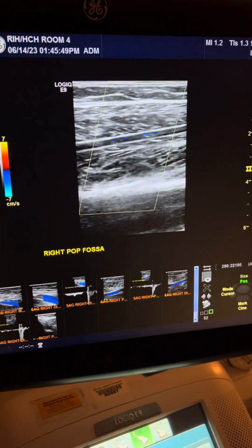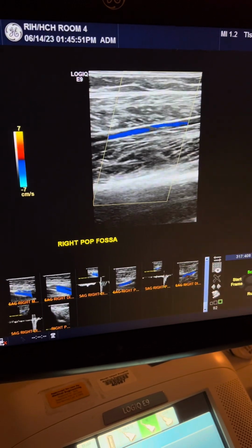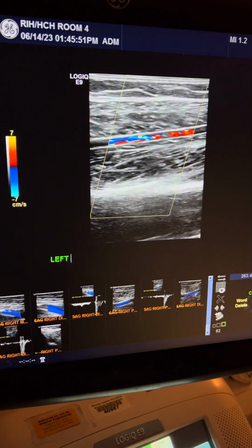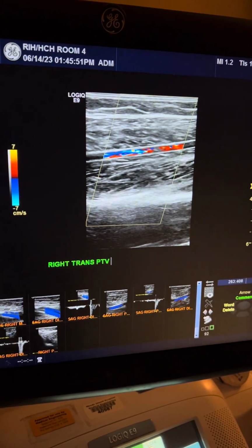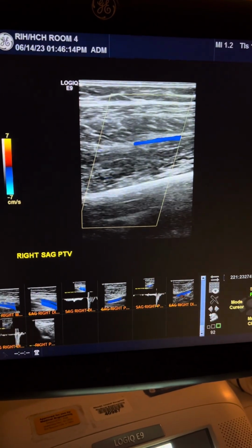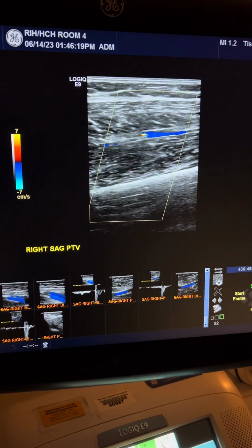So I'm going to take, we have one vein right here. We have another vein here. So these are sag. Let's see if I can get that again. So my slow flow is still on. So I can see those are posterior tibs right here. So here's one.